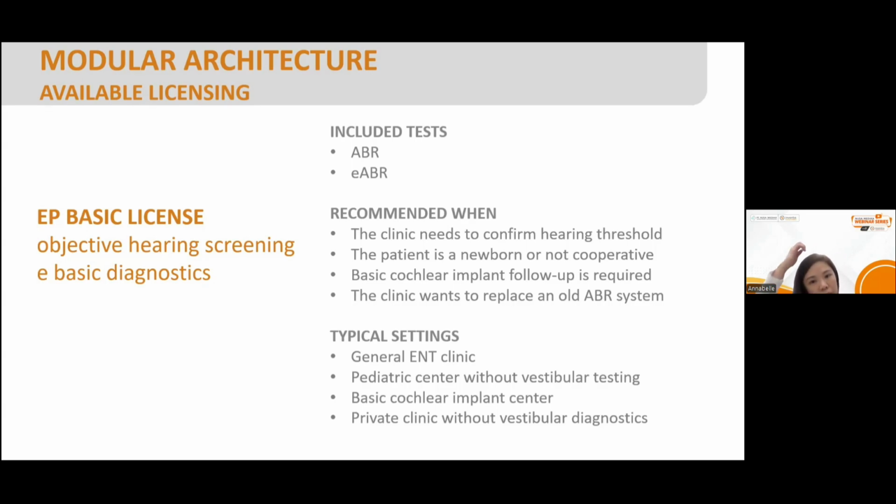Okay, so for the EP basic license, I think it's good for hospitals who need the ABR, AABR, and then after some cases they refer, not passing the first ABR in the first few days of life, like day 0 to day 3 of the newborn, then after 1 month, the baby goes back to the audiology clinic to do the ABR, to test whether they pass again after maybe cleaning up the ears.